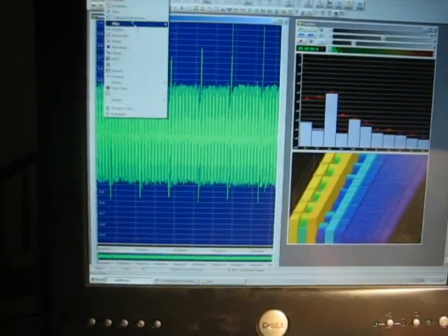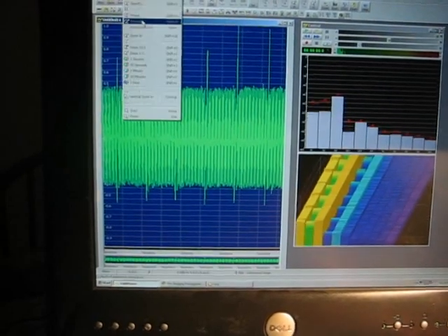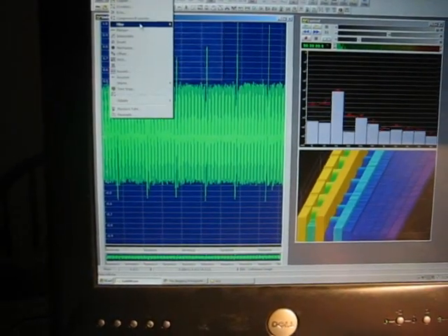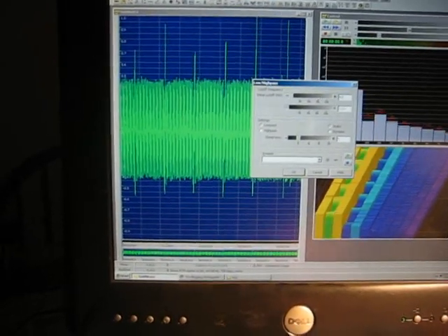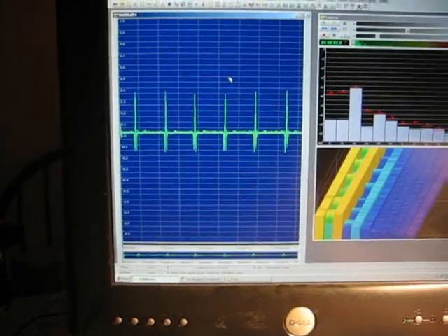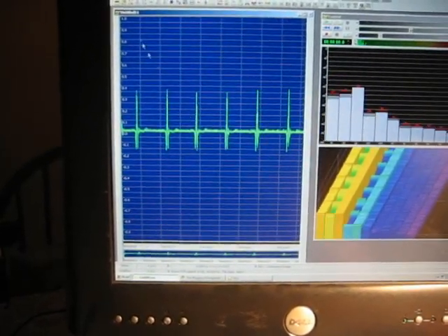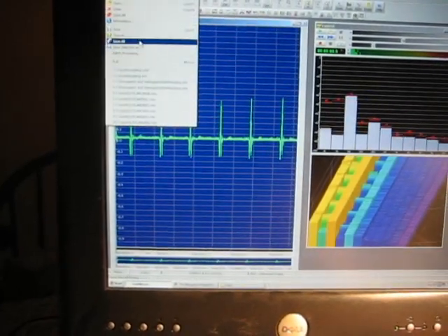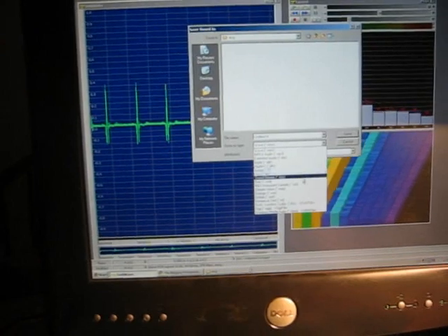The easiest way to remove it is to apply a digital filter. I'm just going to do a band pass filter. So filter, this is going to be a low pass. I'm going to only allow things that are lower than 40 Hertz. Now you can see the heartbeat is really clear, and you can actually differentiate the P, Q, R, S, and T portions of the wave. You can look it up on Wikipedia if you need to.